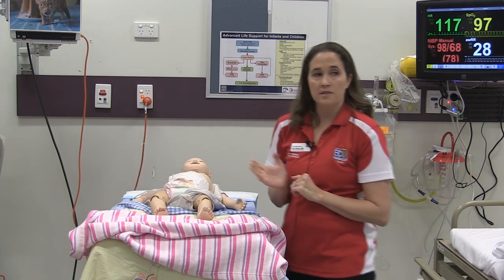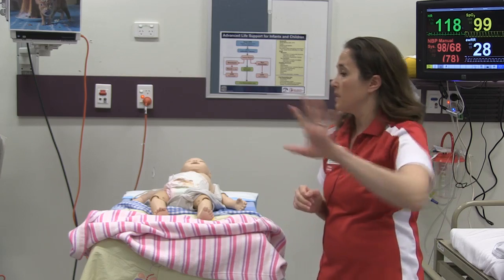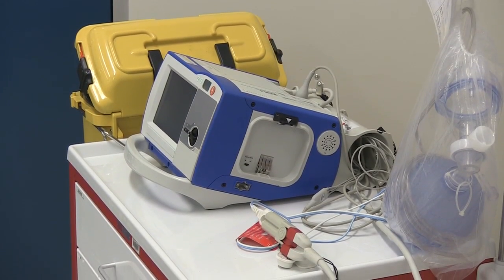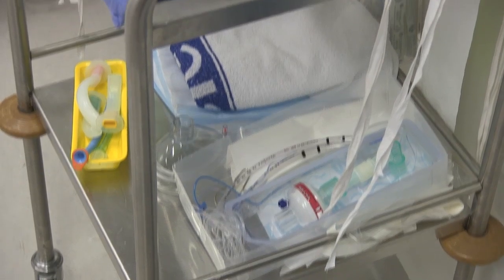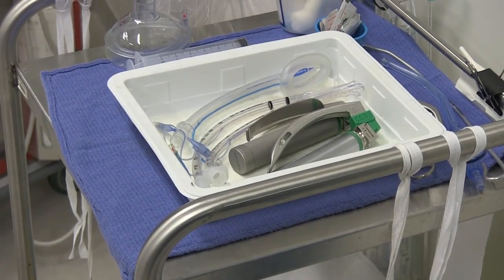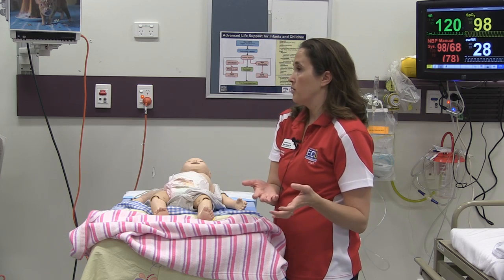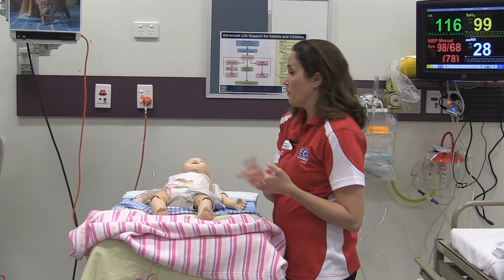Sorry, I guess the only other thing I would say is when we come into the room, we have any basic needs that they're going to need out for them. So here's a pediatric trolley, for instance. So anything that we anticipate them readily needing, we have at their disposal. Like if it was a bladder scanner or something, for example, that would be out in the hallway. We would have it ready in the hallway, but not in the room, because it wouldn't normally be in the room. And then the Confederate can go and get that as it's requested, if it's requested.